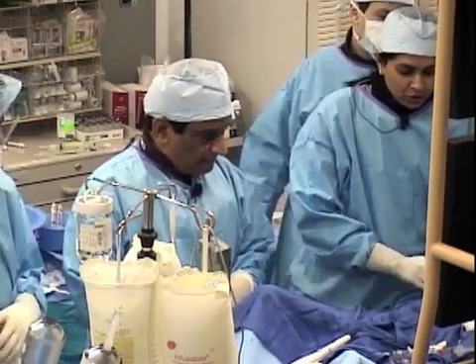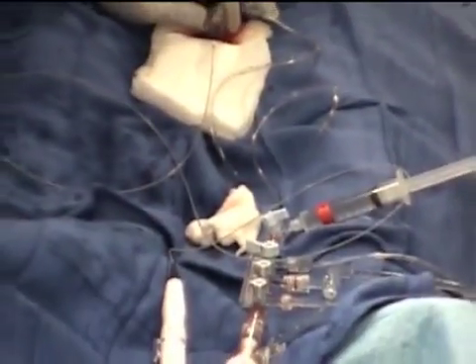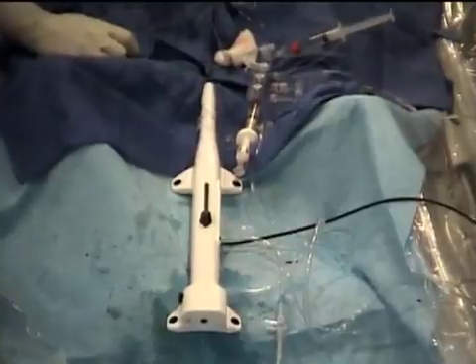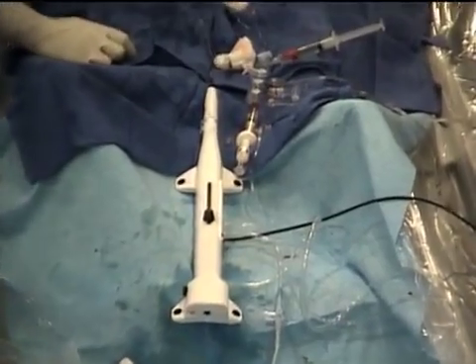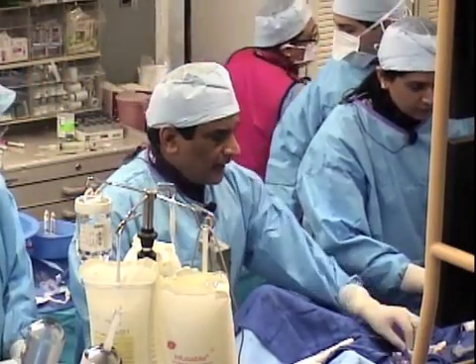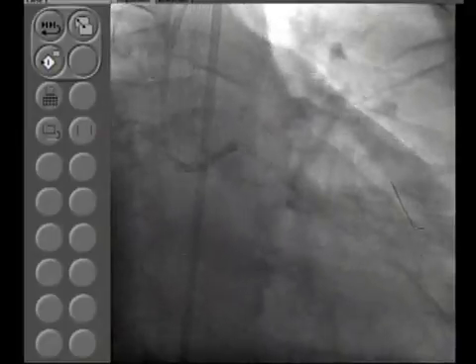Okay, once the burr is close to the Y connector and the wire has come out of the advancer knob, very important, you put this safety clip at the end, and then you check your speed. Increase the nitrogen. Press proximally, not inside, outside. Okay, now we have about 160 speed. Good. About 155 outside, which will translate into 140 or so inside the body. Don't spend too much time on speed, but as long as you get to about 150, 160, that is good enough.